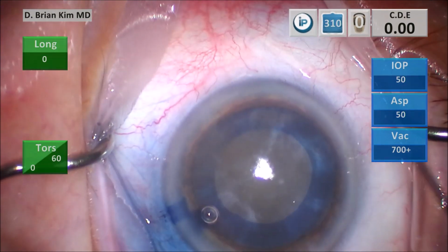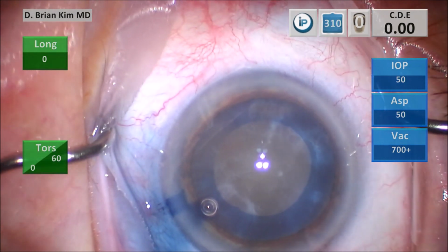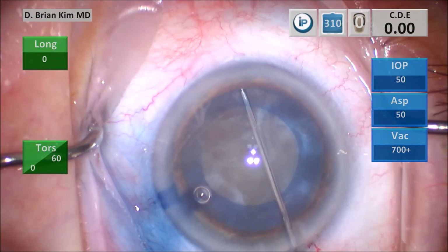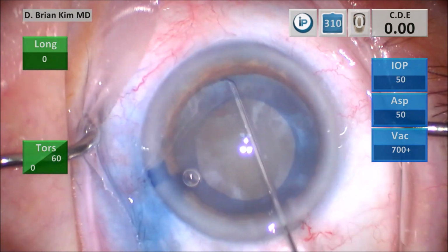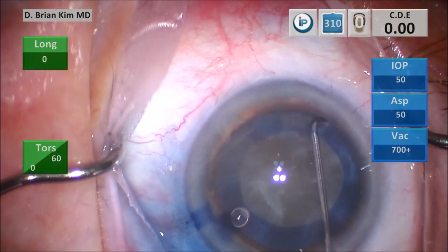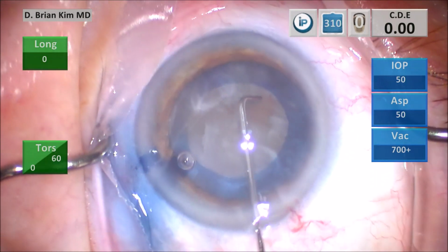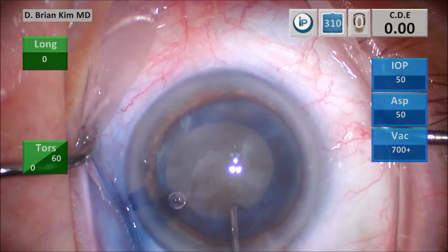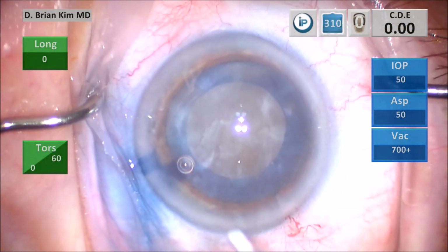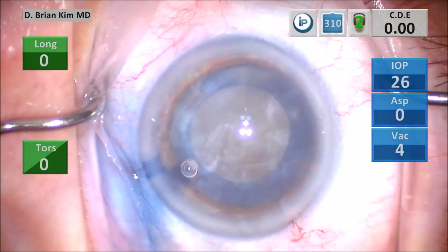This is a capsular fornix hydrodissection technique. I place the cannula out to the contralateral equator under the rexis edge, get a nice wave, decompress on the left side, turn the cannula tip down on the right side, and the lens spins nicely. This lens is unlikely to have much epinucleus or cortex. I think it's just going to be a big, dense lens with very little posterior capsule protection.